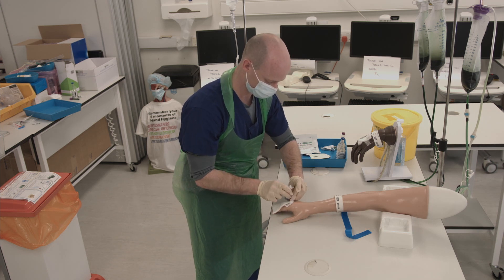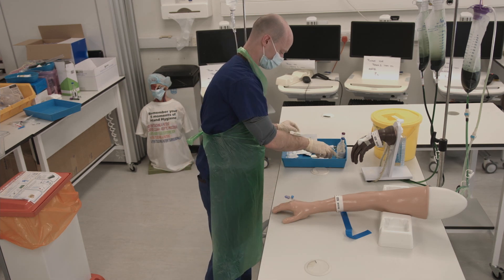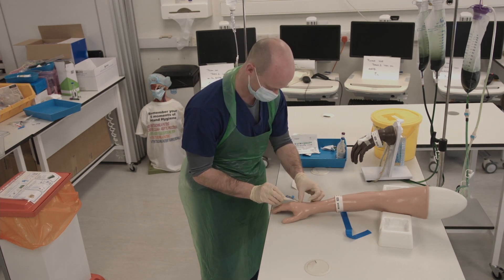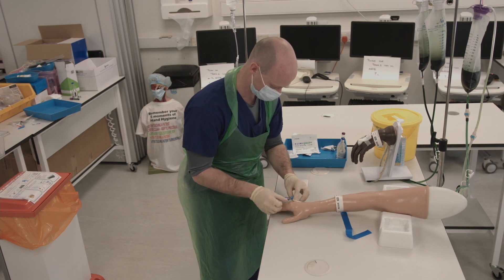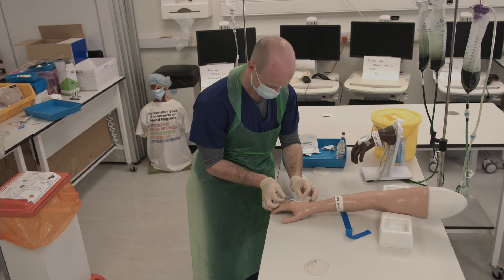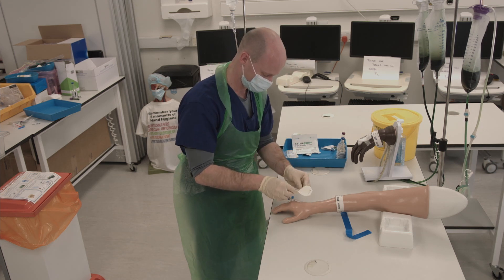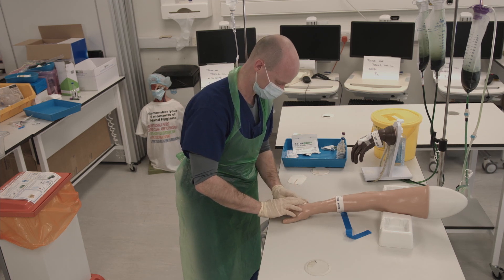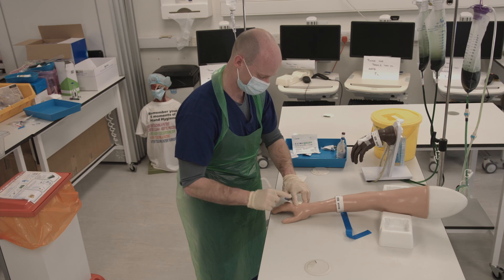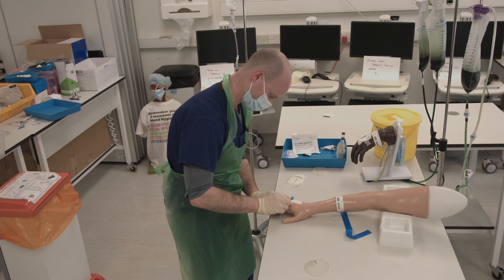Give the saline flush, checking for any swelling around the cannulation site. Remove the syringe from the bung and dispose of the gauze. Attach the cannula sticker, starting with the strips to secure the wings, then apply the main sticker.